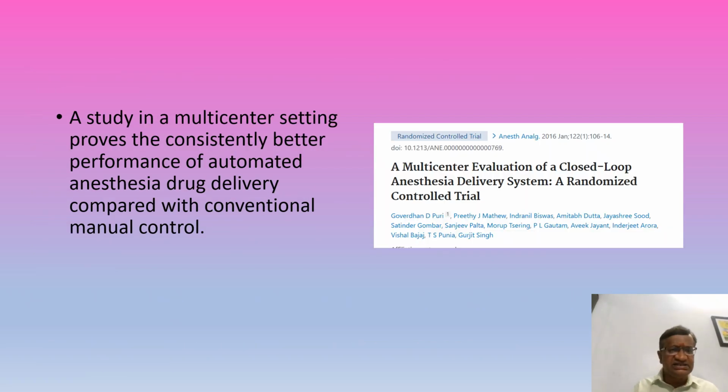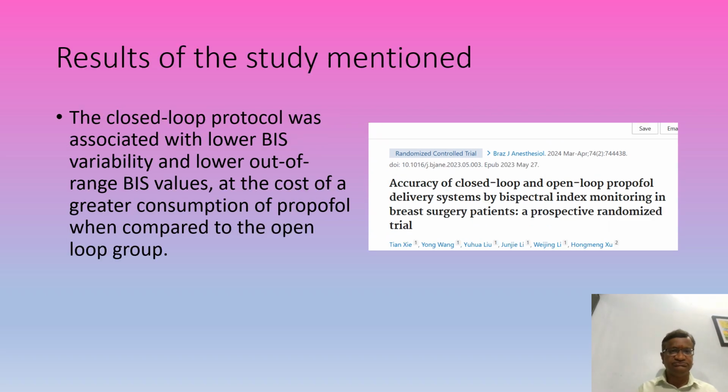A study in the multi-center setting proves a closed-loop anesthesia system compared consistently showed better performance. This is in 2016, Anesthesia and Analgesia. Here, the accuracy of closed loop versus open loop propofol. What is this open loop propofol delivery system? Now, the propofol is being injected.